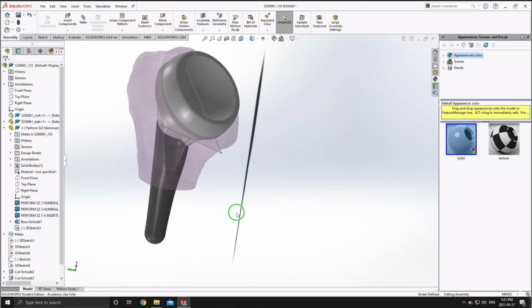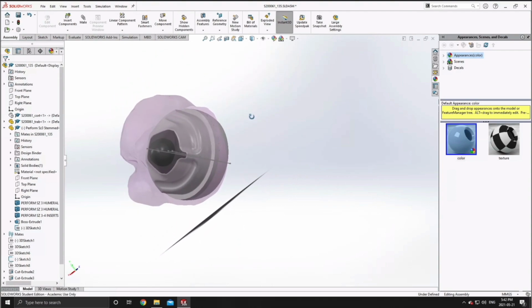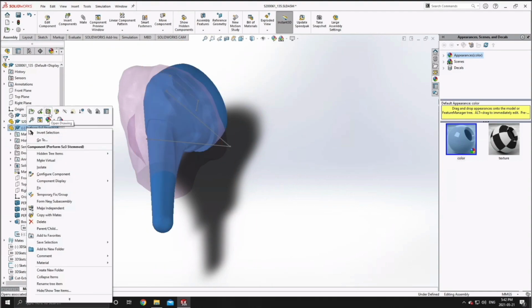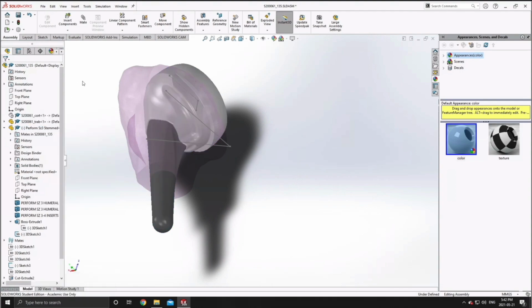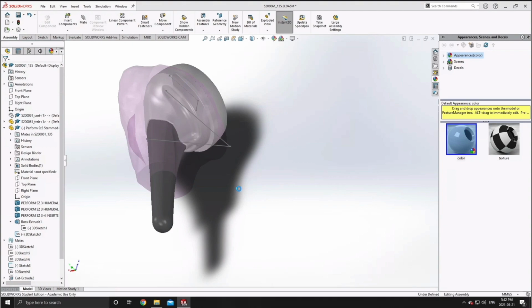Now, as we gradually move forward here, you can see I've chosen our implant orientation relative to the face, but I still need to choose the lateralization of our implant itself. Now, there are a number of different ways to do this analytically, but the main key here is you want consistency with your implant positioning across your patient groups. So you can see here, I've set the trabecular bone model to be transparent, so I can just verify that there's no impingement of my implant on the surrounding cortical bone.